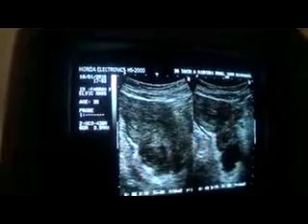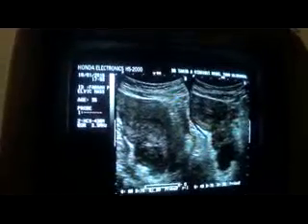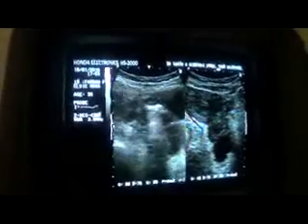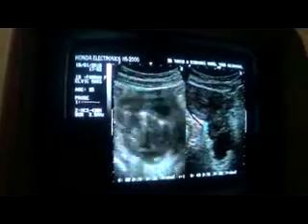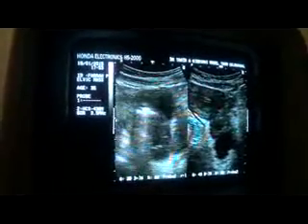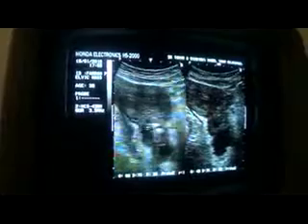She inserted something, she does not know what, and then she started having pain in her rectum during defecation and post defecation. You see that now this is the cause of all this collection, which is in fact due to manipulation, and the collection extends from the posterior wall of the uterus.